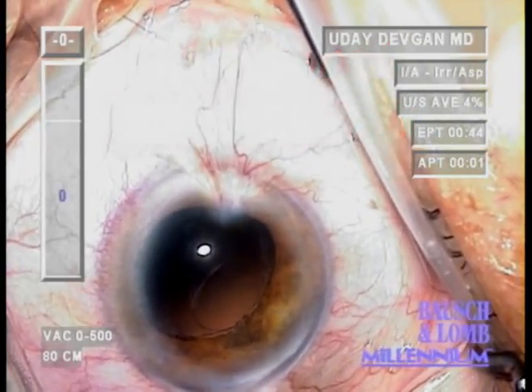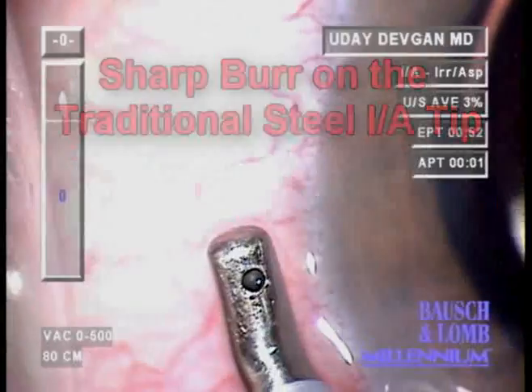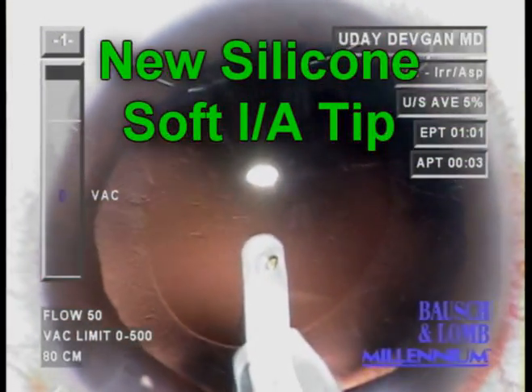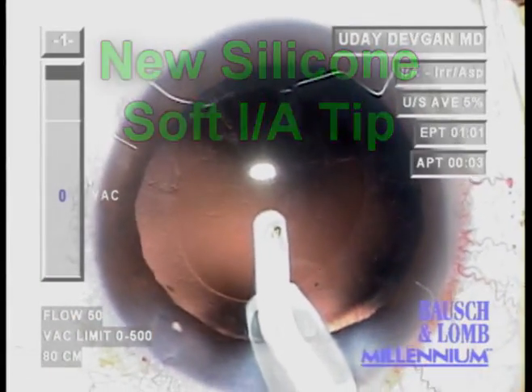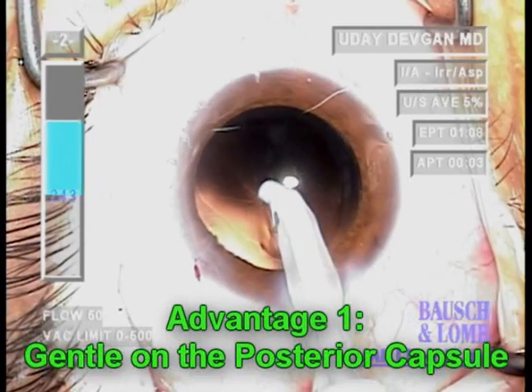When we closely examine the steel tip, we notice at the aspiration port a sharp burr. The new silicon soft IA tip is completely encased in silicon and does not allow metal to contact the posterior capsule. It is therefore very gentle on the posterior capsule.